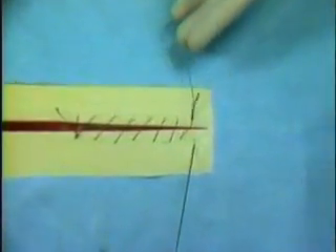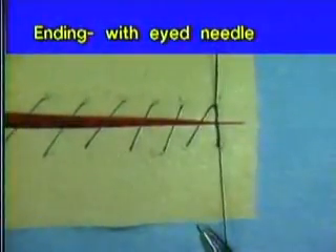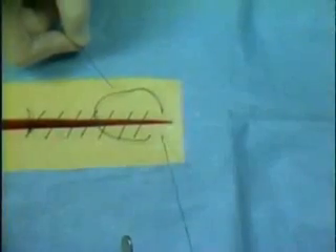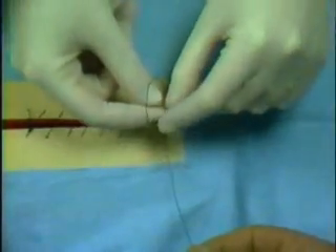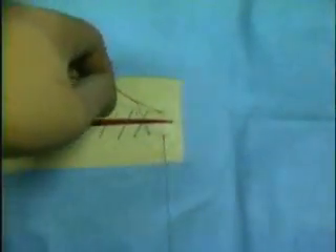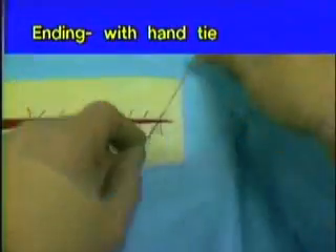With an eyed needle, as the end of the wound is approached, the double strand of suture, which is looped through the needle eye, is taken directly through the final stitch and is tied to the free end of the double strand that is not pulled through the incision. If the remaining end of a continuous line is short and a hand tie is preferred, an additional strand of suture may be passed through the last loop and used as a tether to tie a flat, secure knot.